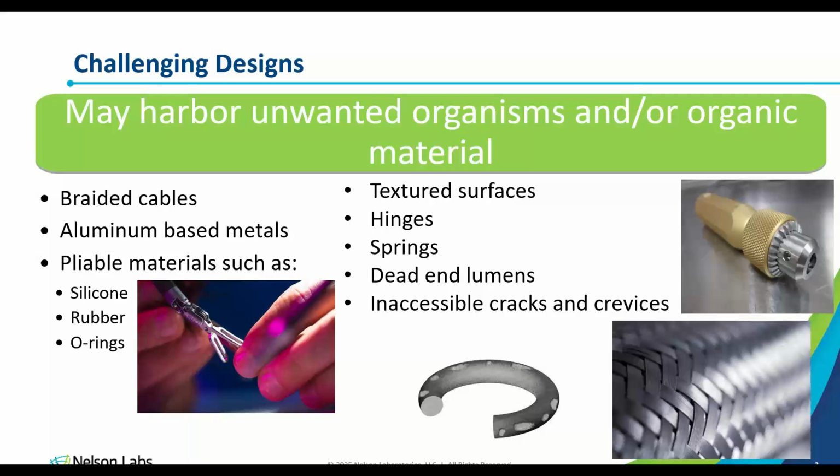So again, look at the extraction method. That's going to include, again, what was the container used, what was the fluid used to extract the device. If your device disassembles, was it extracted disassembled or assembled? If your device does disassemble, it should be extracted disassembled. And then, again, look at the consistency if you have enough data points to evaluate that. So if you have more than one positive control and more than one recovery efficiency, how consistent is it?